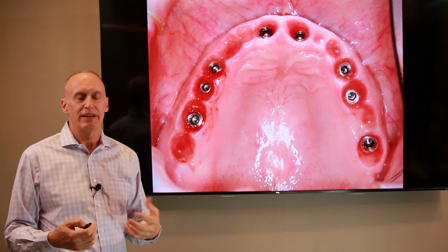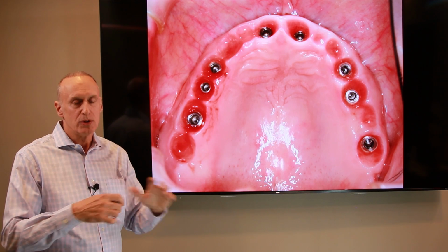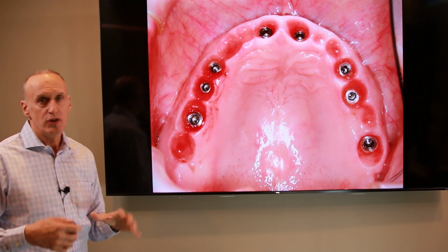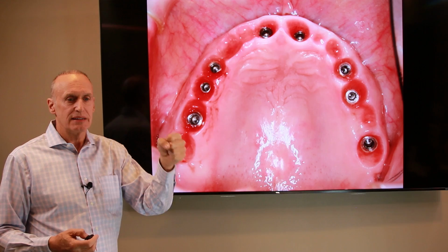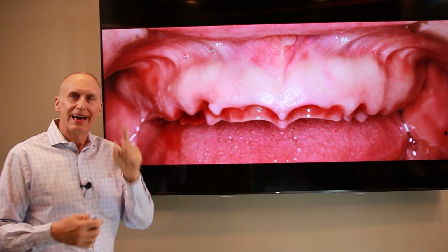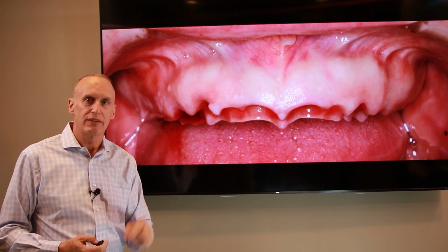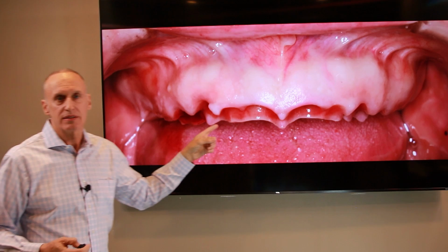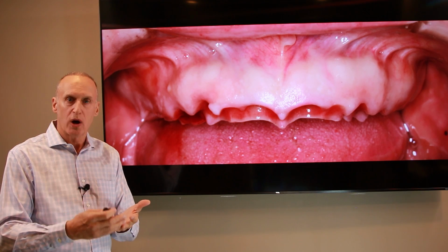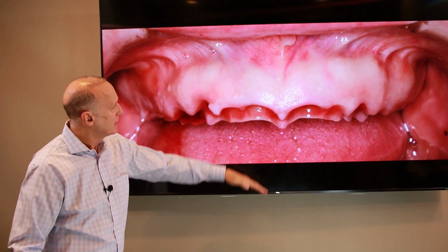But this is why it's so important, and this is why I'm so passionate about it. When you get it right, the tissue response is beautiful. So we've maintained this patient's tissues with proper implant placement, no angle correction abutments, and a direct clean connection from the bridge to the implant. This is what it results in. This is what every single one of you wants. This is what every single All-On-4 doctor would want if it was his or her own mouth. This is the gold standard for implant dentistry. Maintaining hard and soft tissues, which is bone and gum tissue, and maintaining the shape so that it's simply a recipient site. It's the frame that the teeth go into.